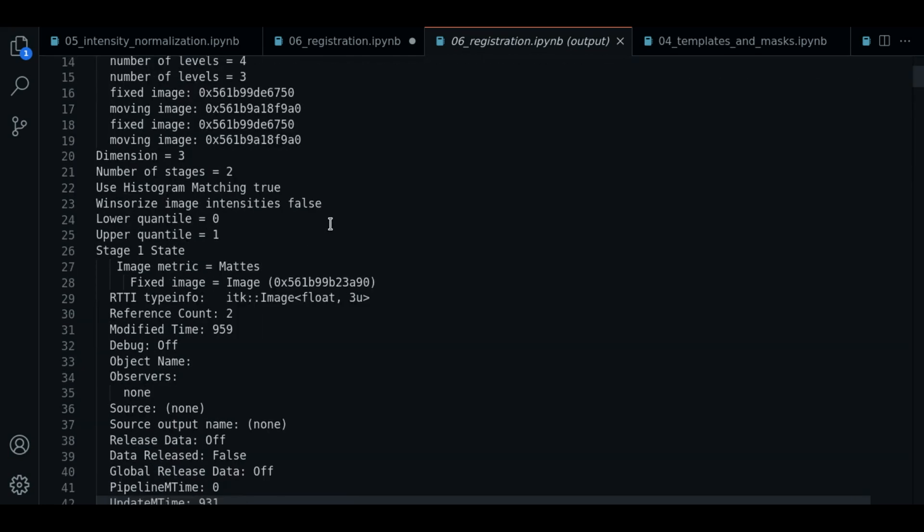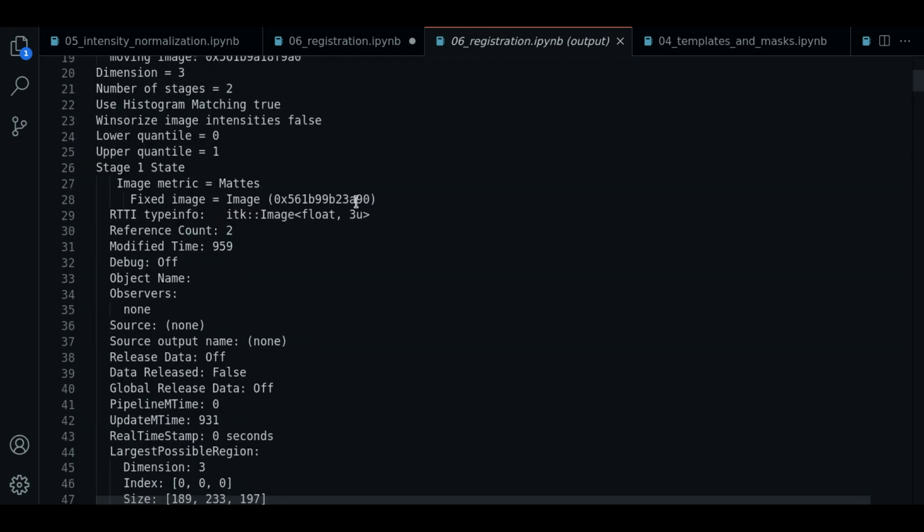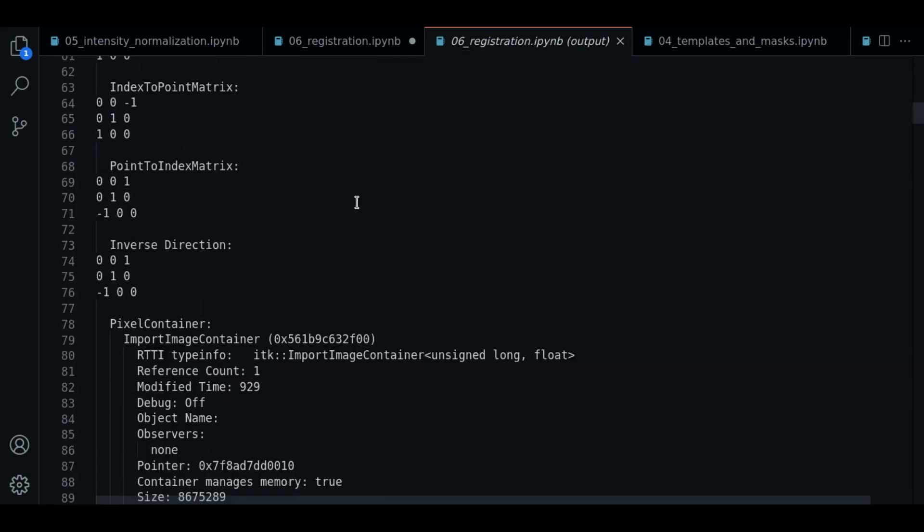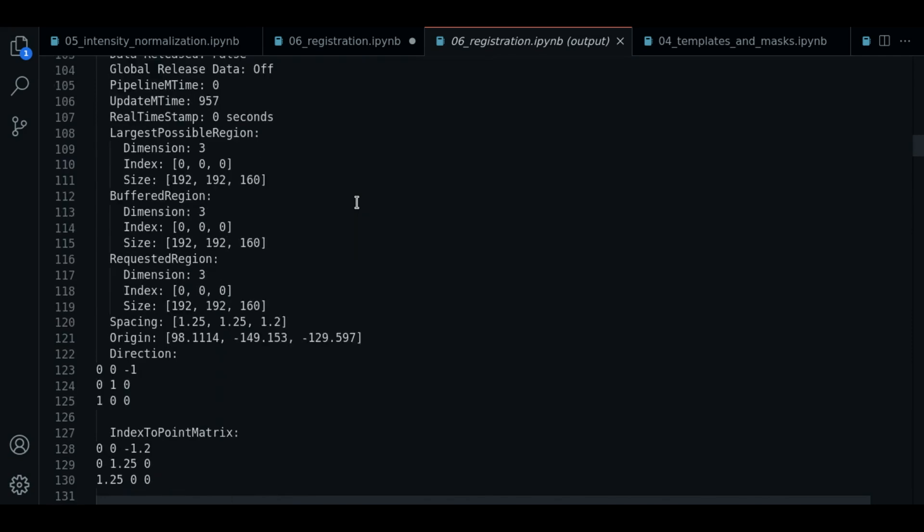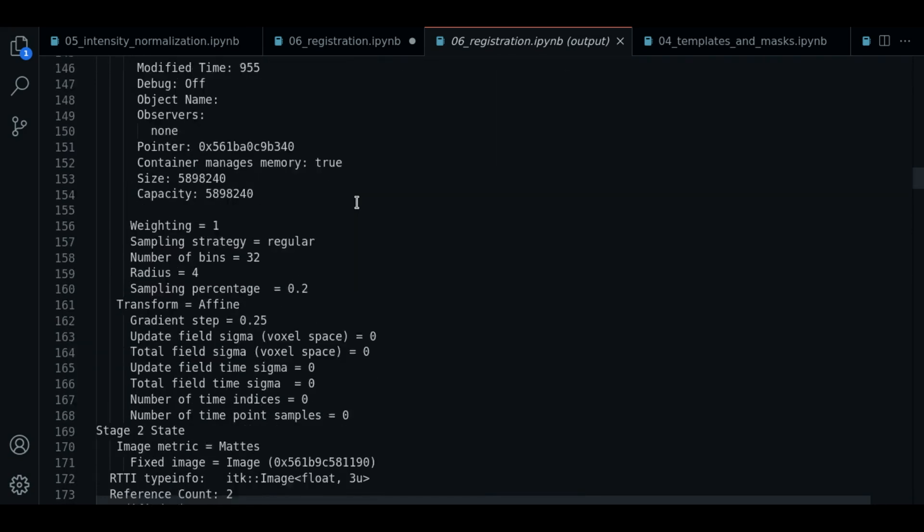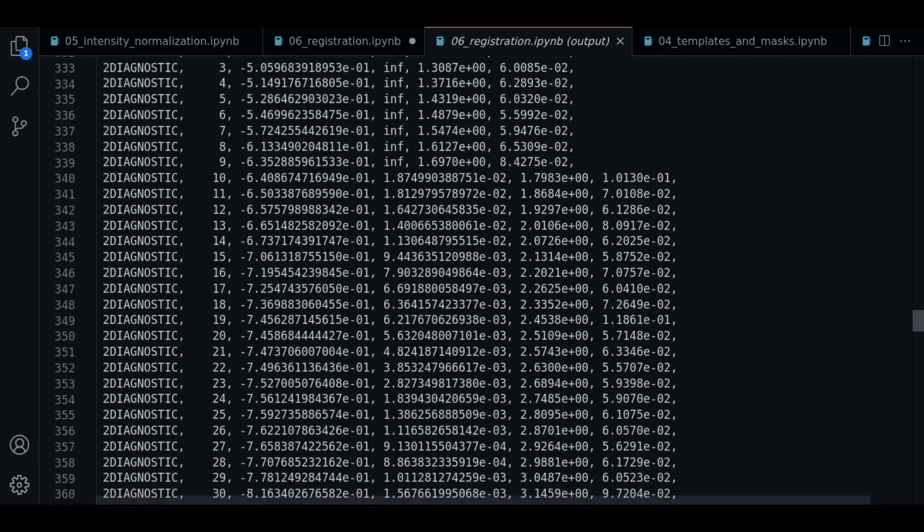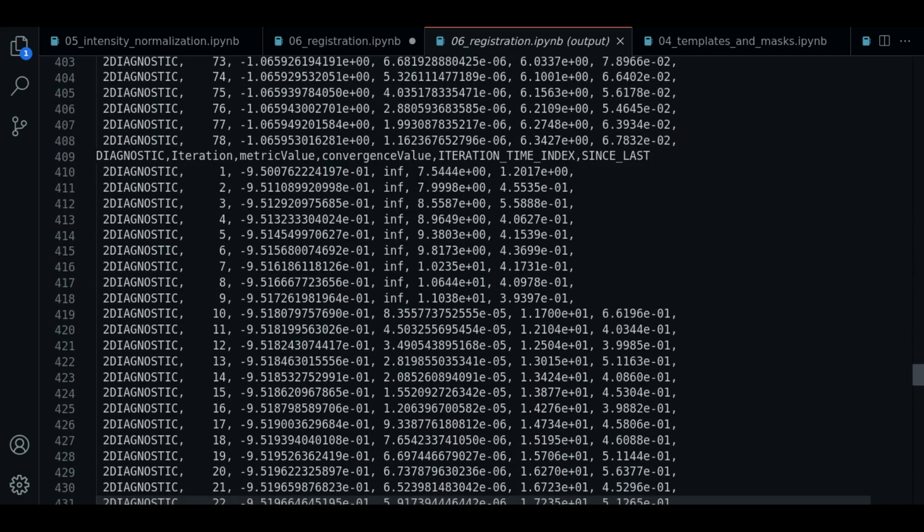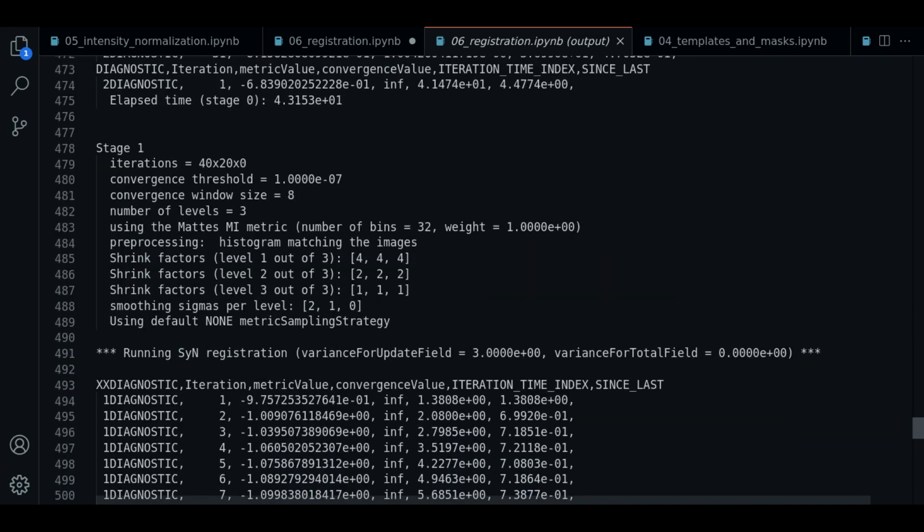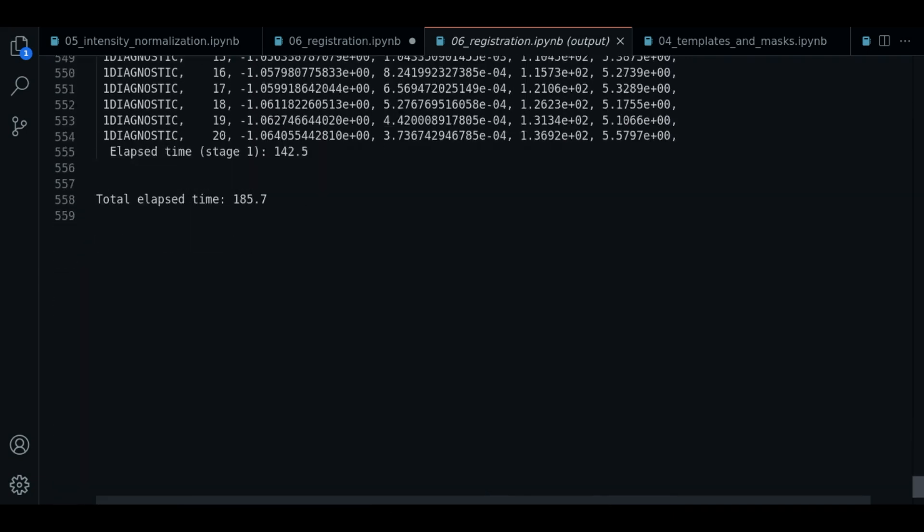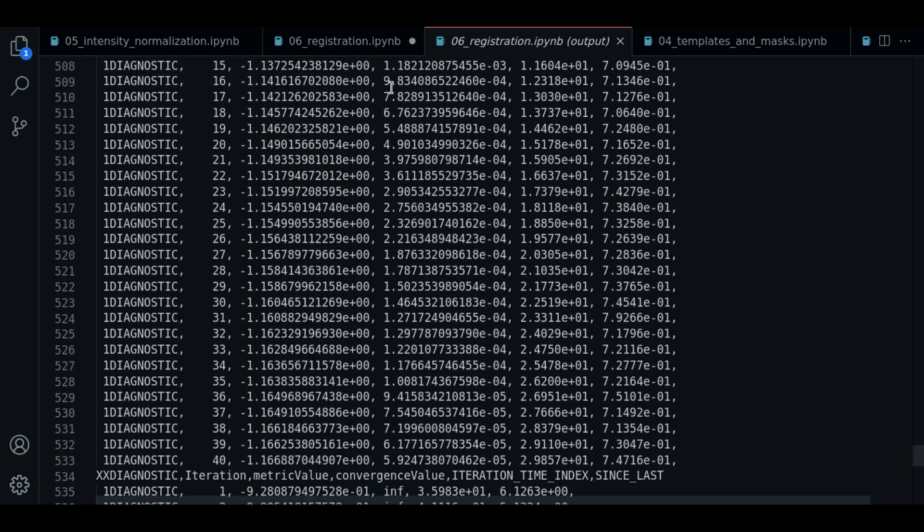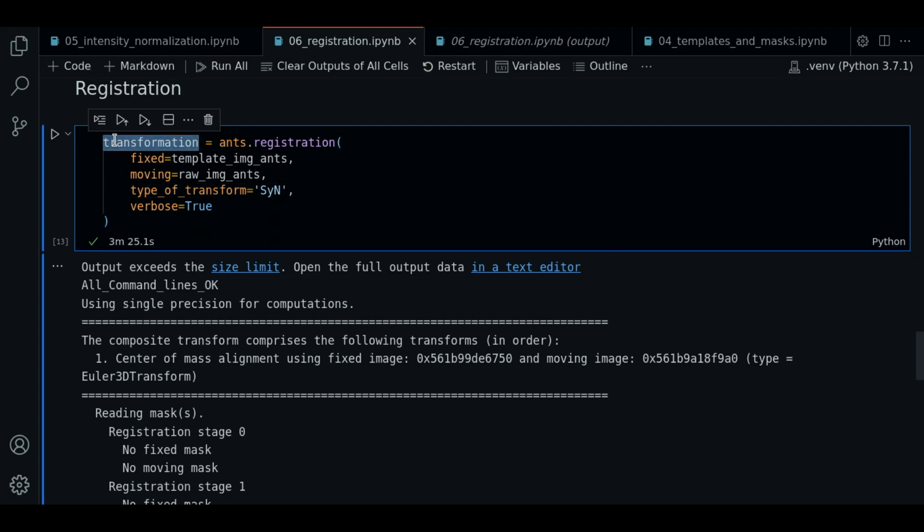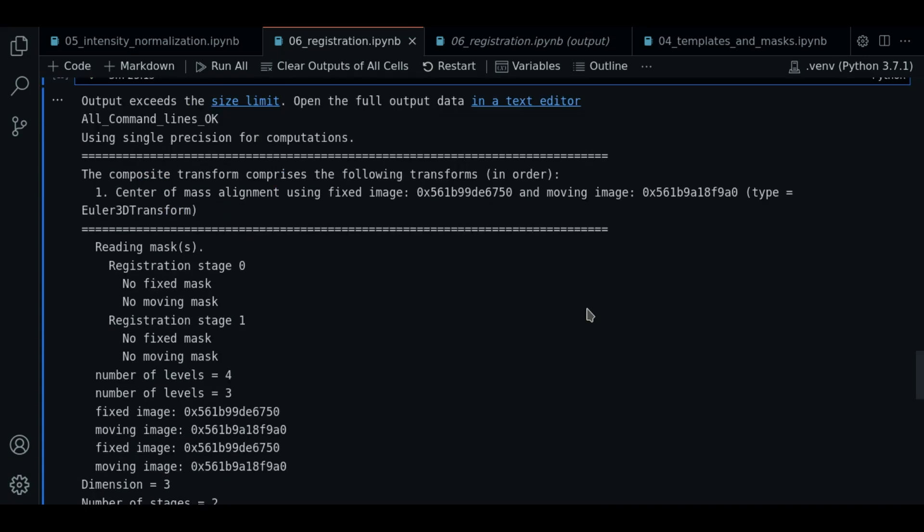So as you can see, this is a bunch of technical stuff about all the operations done during the processing, during the registration algorithm. So we're not going to use this information. It's only for you to know it.